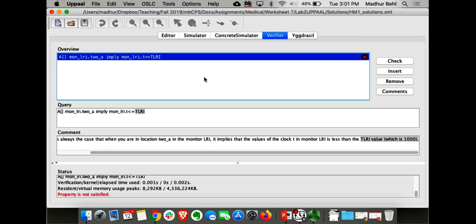And it makes sense because we have designed the values of the rest periods and the wait times such that they all add up to 1,000 and no more than 1,000. But in bradycardia, when your heart rate is slow, it is indeed expected that the V to V interval would be more than in regular normal sinus rhythm, which is 1,000 or 1 second.